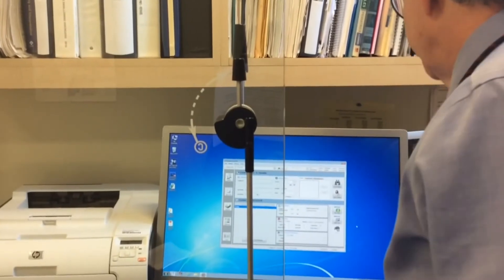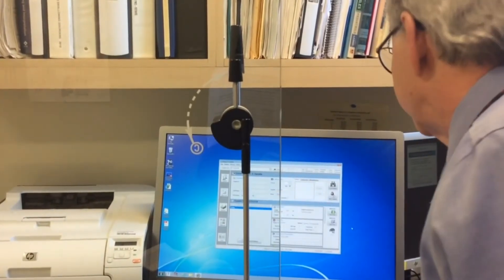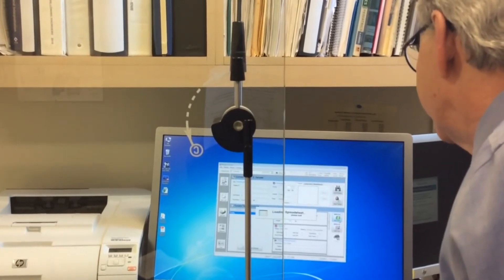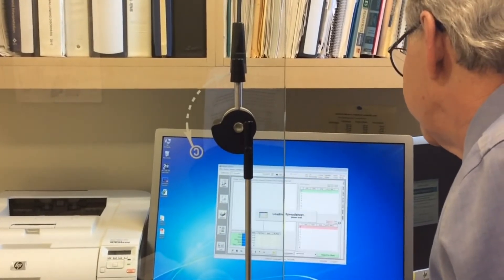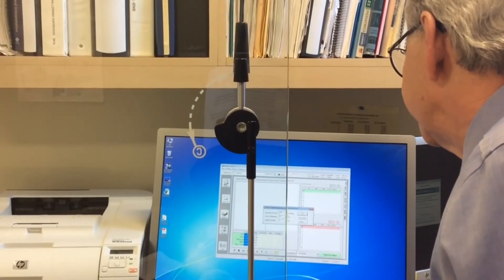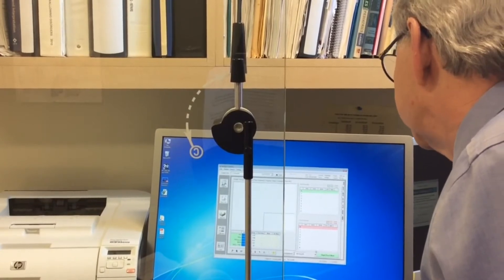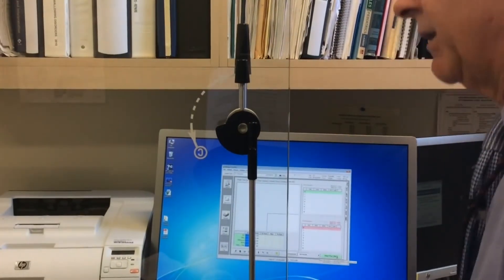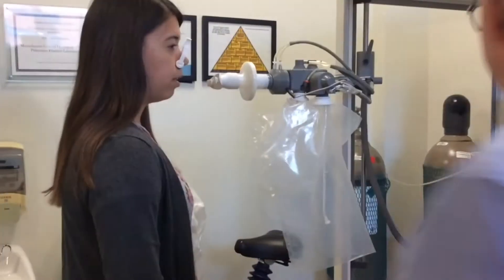We're going to check that we have all the information about Danielle in the system. At this point we're going to run the test — load the spreadsheet, check the environmentals, and I'm going to demonstrate to Danielle exactly what I want her to do.